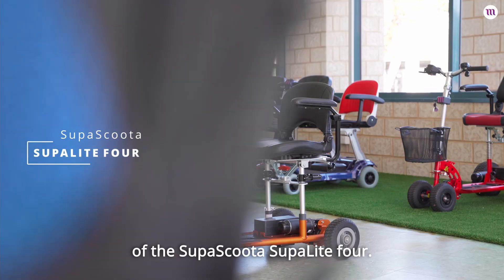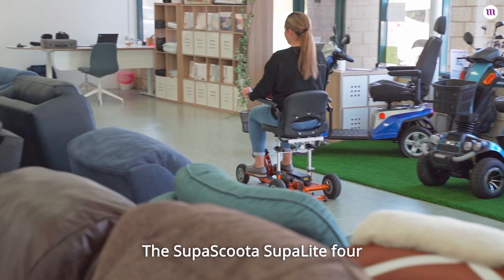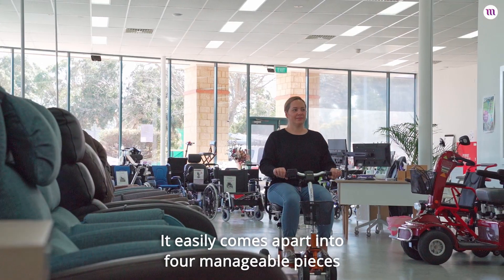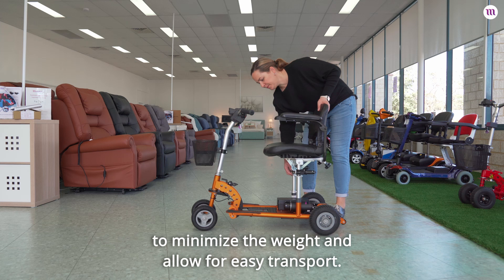In this video I'm going to give you an overview of the SupaScoota SupaLite 4. The SupaScoota SupaLite 4 is slightly larger than the MicroLite and comes with four wheels for added stability. It easily comes apart into four manageable pieces to minimize the weight and allow for easy transport.